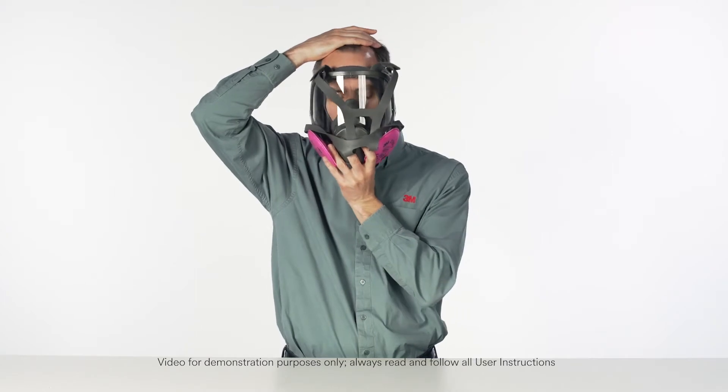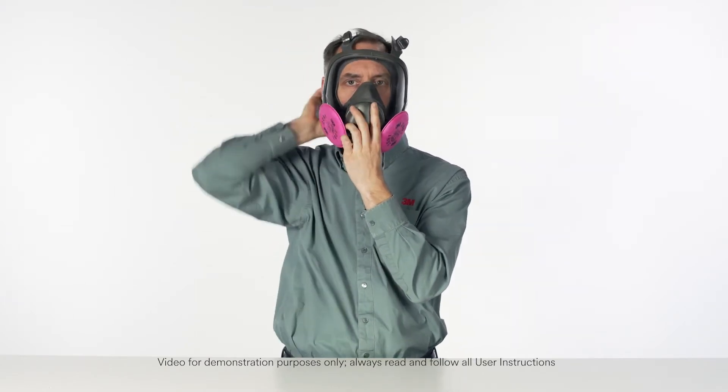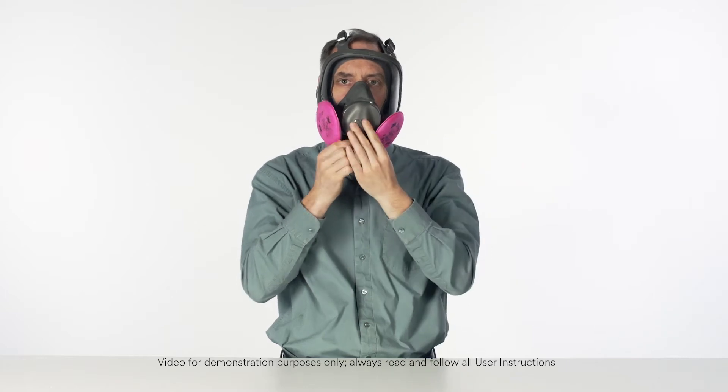If engineering controls or other measures are not sufficient, you can help reduce your exposure to certain airborne contaminants by wearing a respirator. Each time you wear a respirator, you must know the proper fitting procedures and follow them carefully.